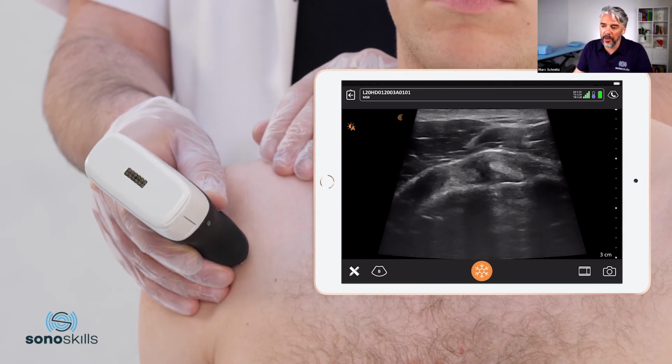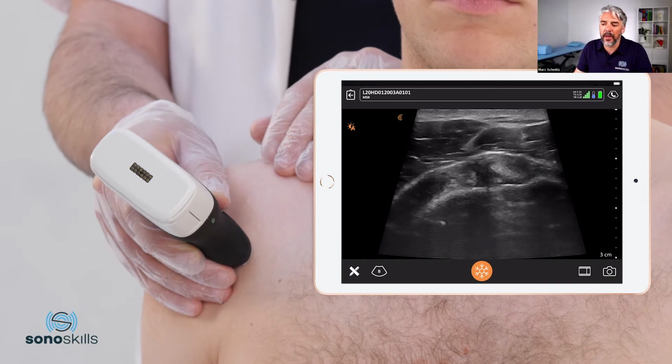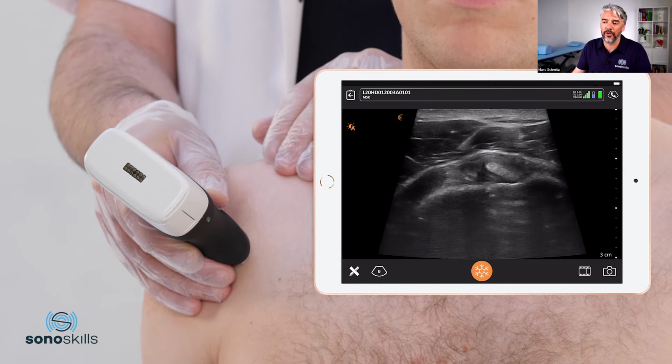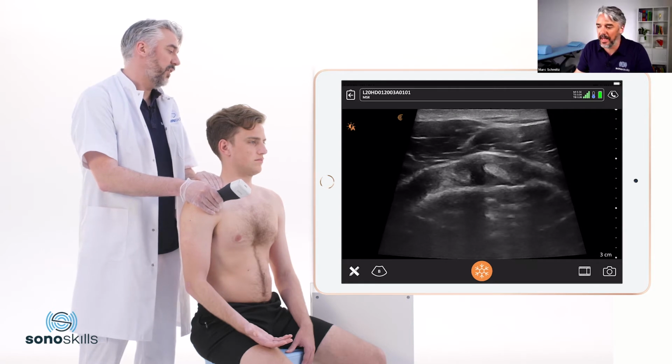So it's not only about cross-sectional scanning. We could also do longitudinal scanning. But to start, I would always choose the cross-sectional, because this gives a nice overview and also a better understanding of the anatomy.